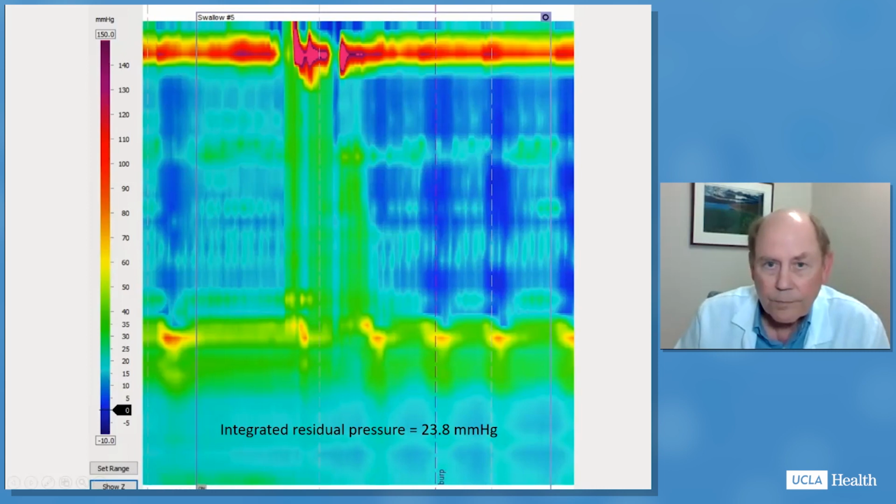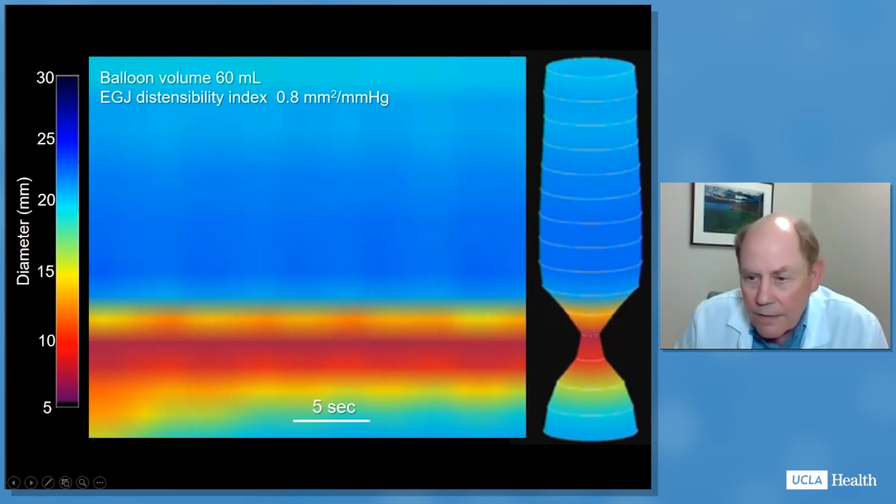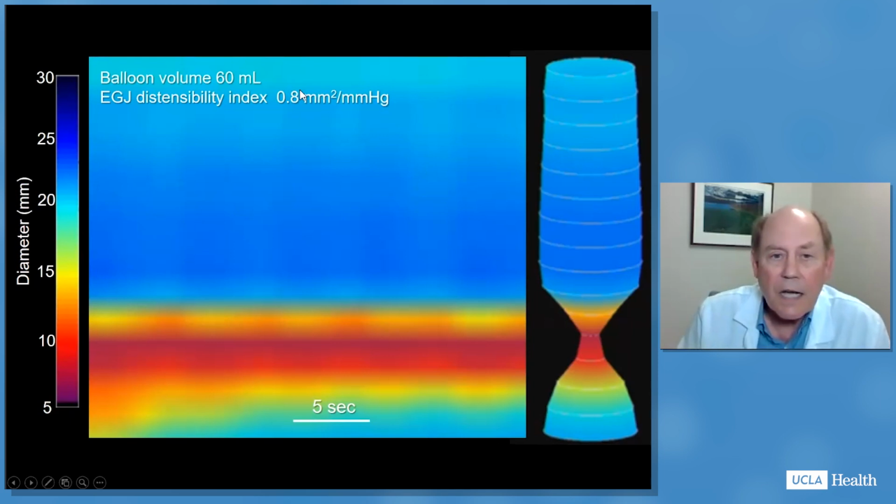So what did we do? We did the EndoFLIP, right? So this image is at balloon volume 60 mLs and the EGJ distensibility index, this spot right here, right at the narrowest spot, is 0.8 millimeters squared per millimeter of mercury, which is too low. So this is abnormal. She did not have a stricture, and she has no peristalsis. So we said this looks compatible overall with achalasia. The patient was sent for a POEM procedure, and she's done very well following the POEM. Things have improved dramatically. Her dysphagia is much better.